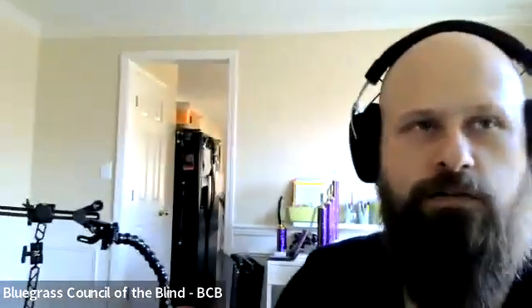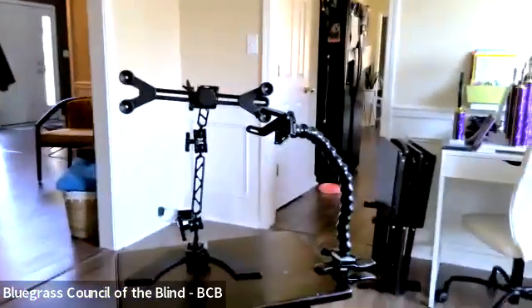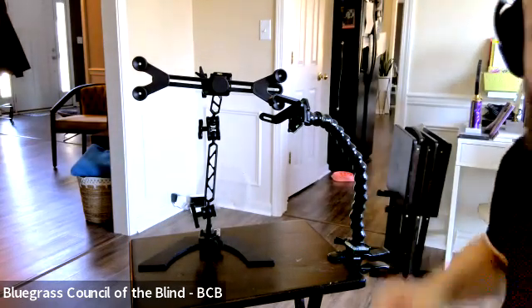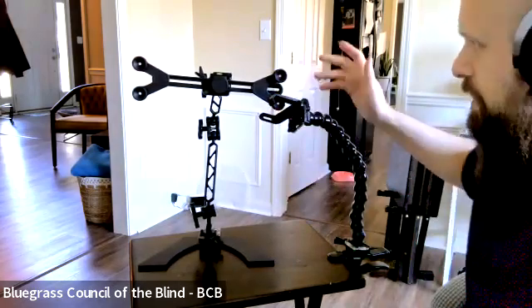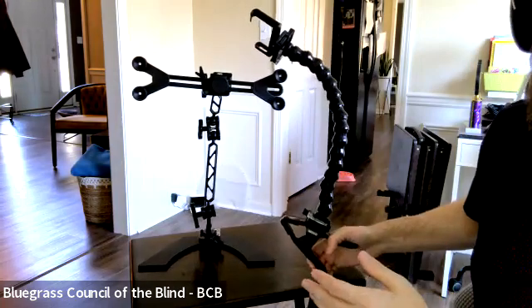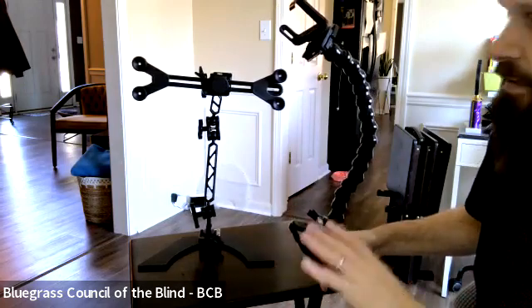Now, one thing you could also do if you needed more of a permanent setup or more of a fixed setup, say you want to do your bills or do your taxes, or you have to do some homework, you can create basically the equivalent of a CCTV. If I can get my camera in there, there we go. By using smartphone and tablet stands. I just have two here. These are both from a company called Modular Hose, and the website is modularhose.com. I love these things. I've been using these for years, and they just work really, really well.